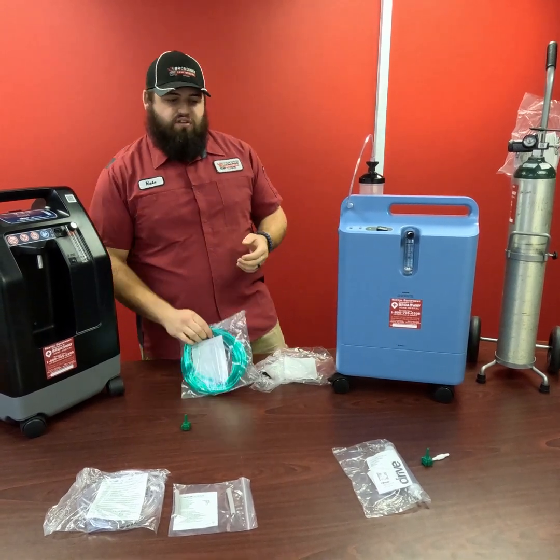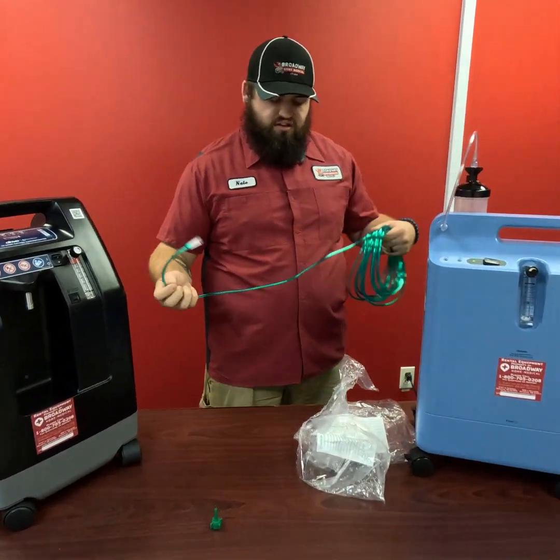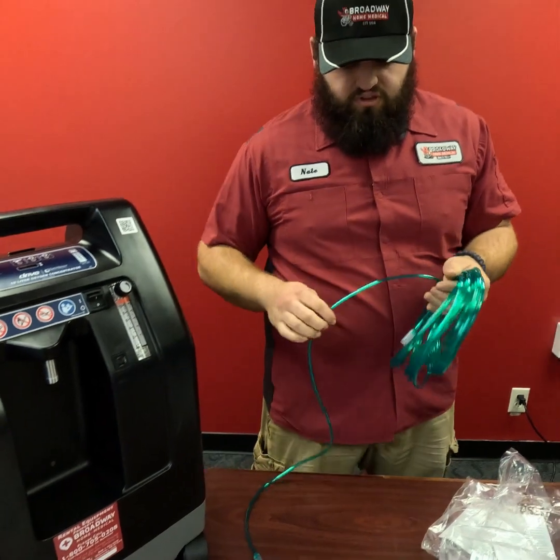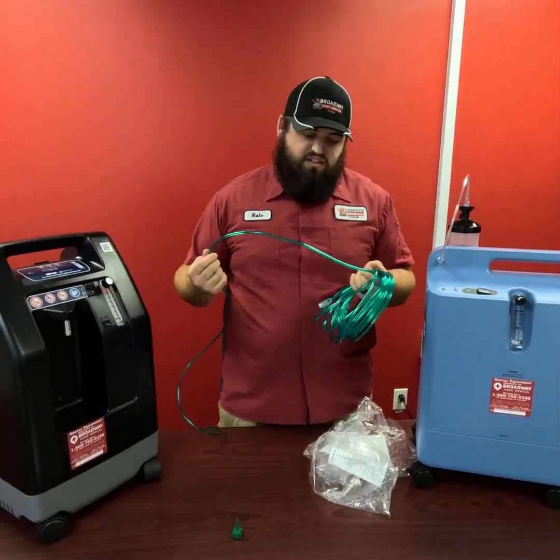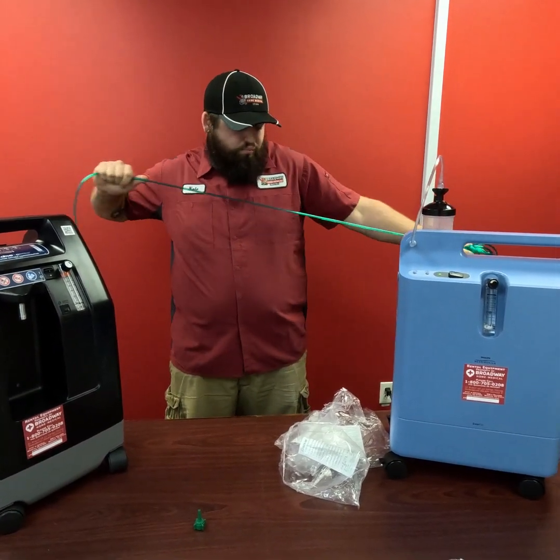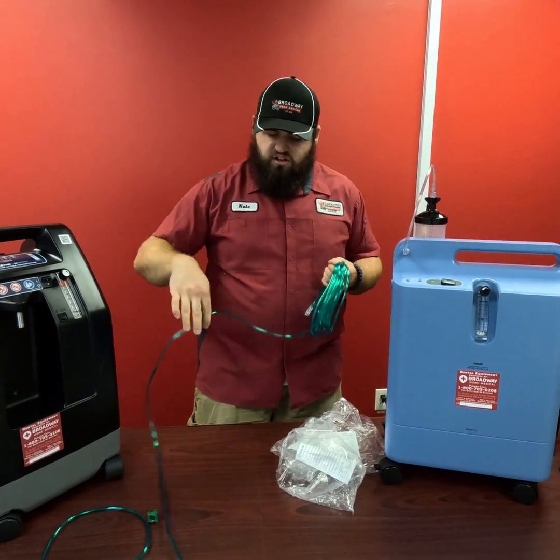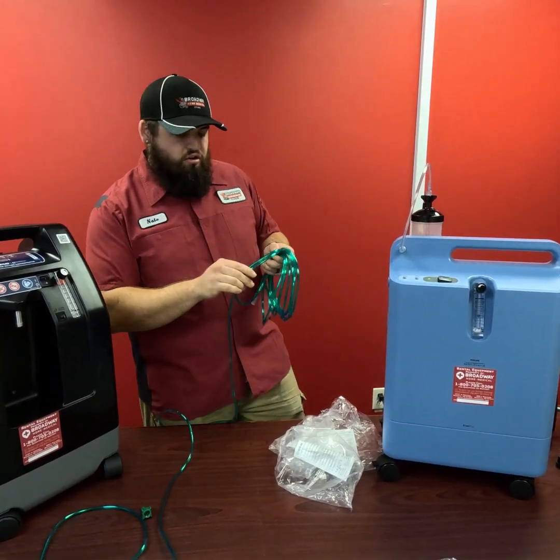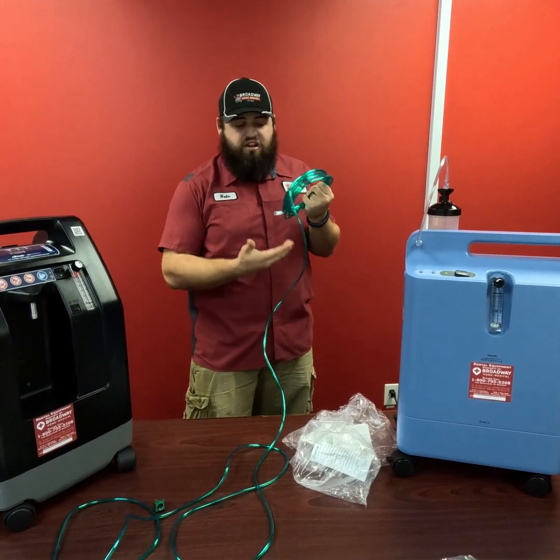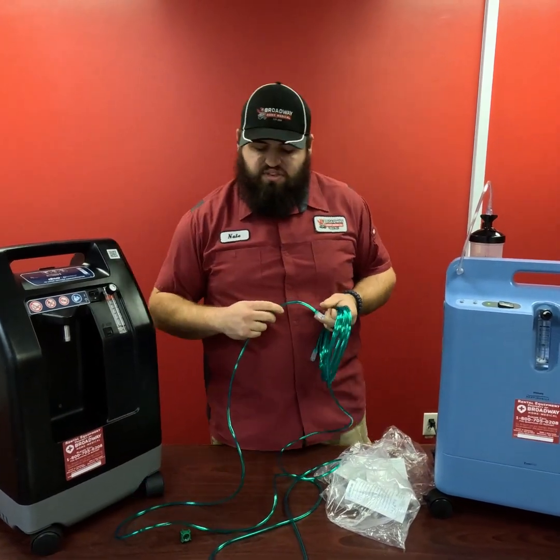One thing I do recommend whenever first setting up these hoses is I recommend pulling these hoses out and giving it a good stretch. When you first pull these hoses out, you're going to notice that they're very, very rigid, and they want to try to bunch back up on you, twist and turn. When you pull it and give it a good stretch, they become a lot more limp and allows you to use this hose a lot easier with less kinks. So I do always recommend that everyone gives their extension tube or their brand new extension tube a good stretch right out of the package. That way you kind of experience less issues with that.